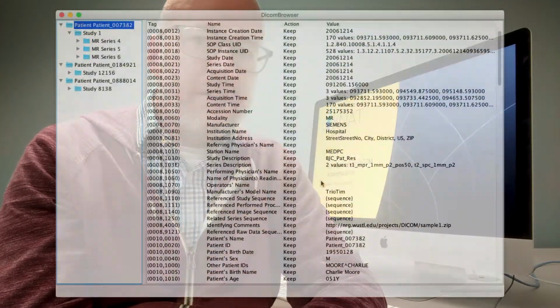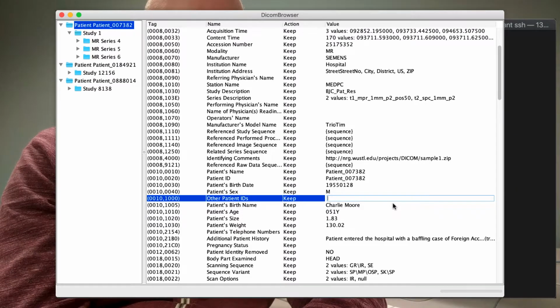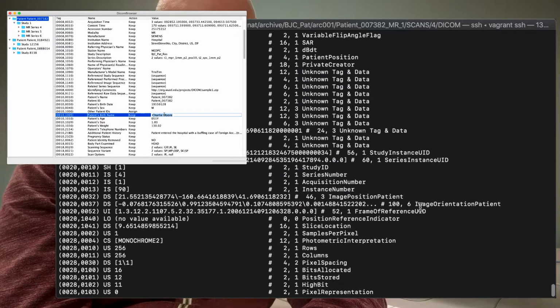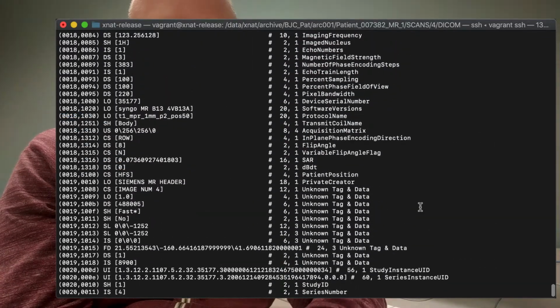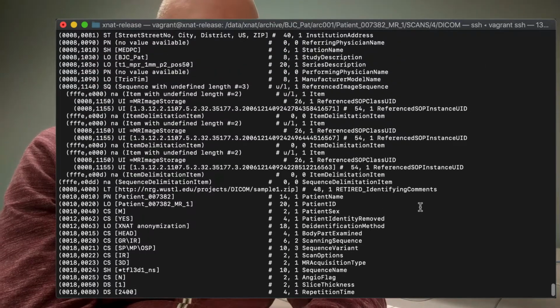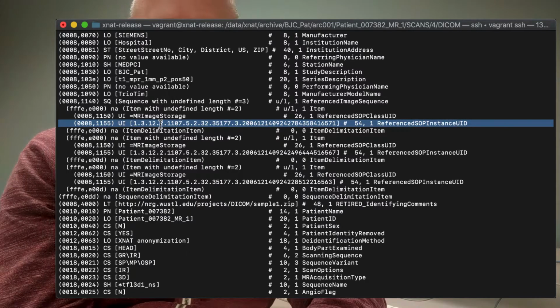It's important that you get representative image sessions directly from the dataset that you plan to support, or from the same source at the very least, and use one or more tools like DICOM Browser or DCM4CHE to inspect the DICOM metadata of that session to see how you will need to construct your anonymization scheme. For example, valuable scan parameters can be stored in DICOM sequences, but these can also contain copies of UIDs or other identifiers.